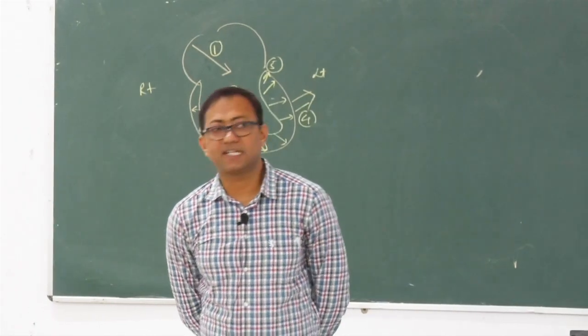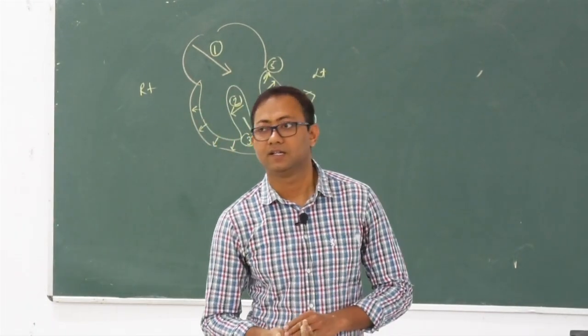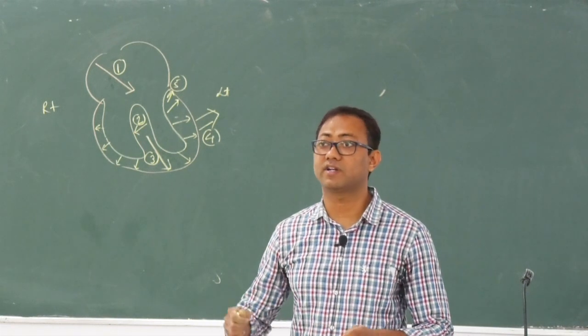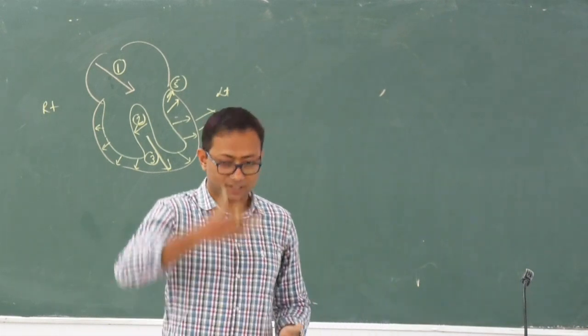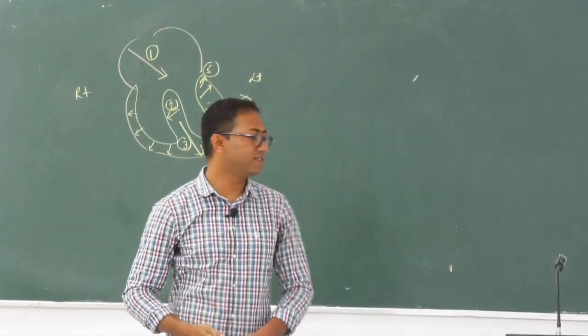Now, ECG leads are attached in 2 planes. One is the coronal plane. What is coronal plane? From your prior knowledge, what is coronal plane? Coronal section, sagittal section, you don't know? Yes. Correct. This is the coronal plane, right?